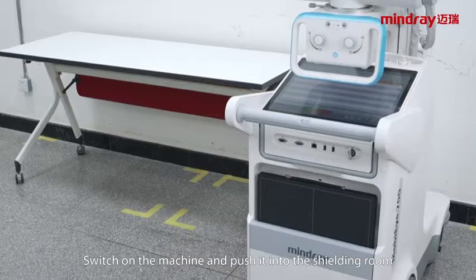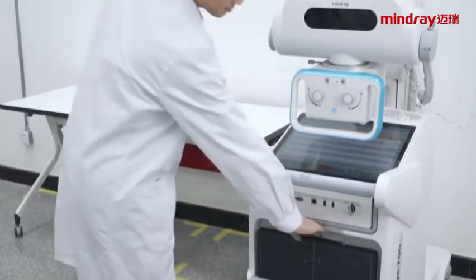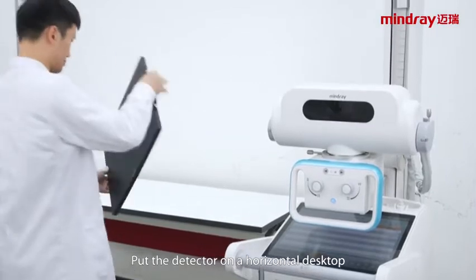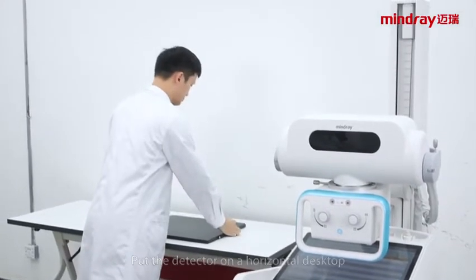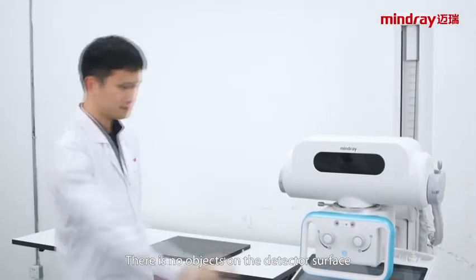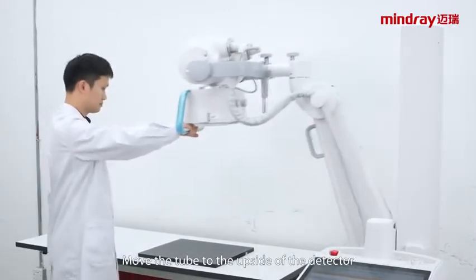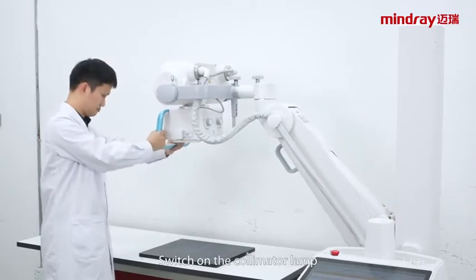Switch on the machine and push it onto the shooting room. Adjust the position of the machine. Put the detector on the horizontal desktop with no objects on the detector's surface. Move the tube to the upside of the detector and switch on the collimator lamp.